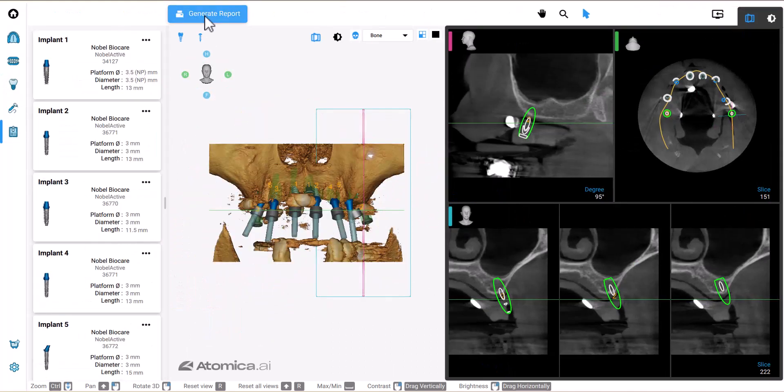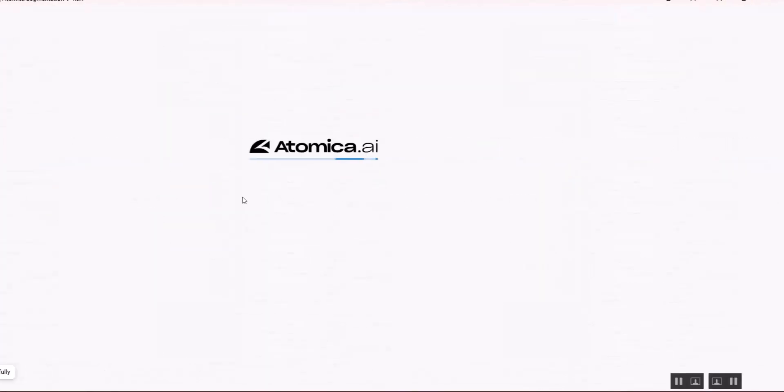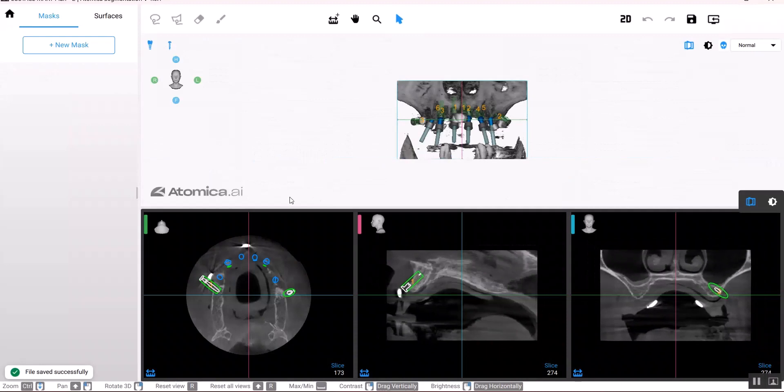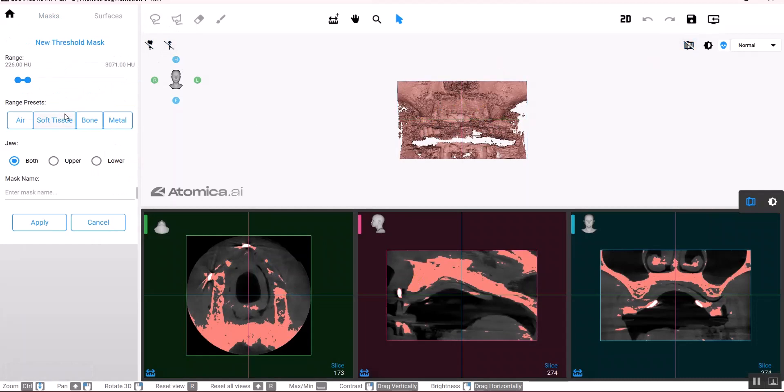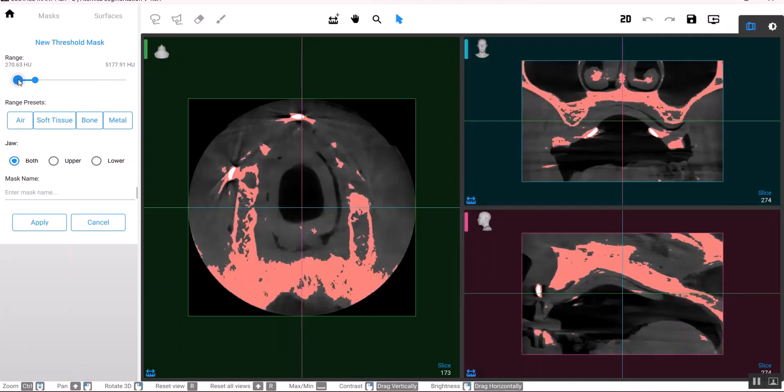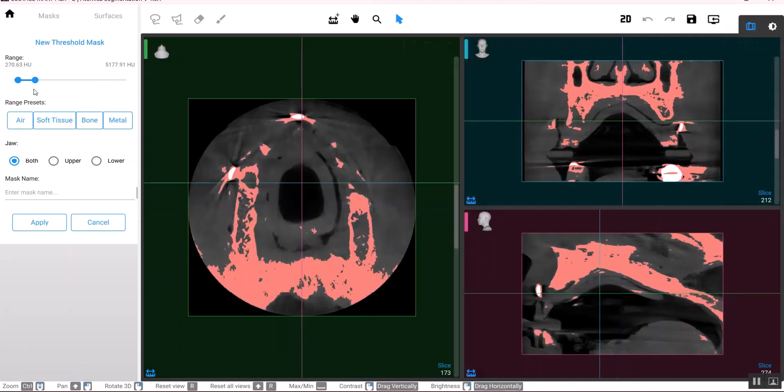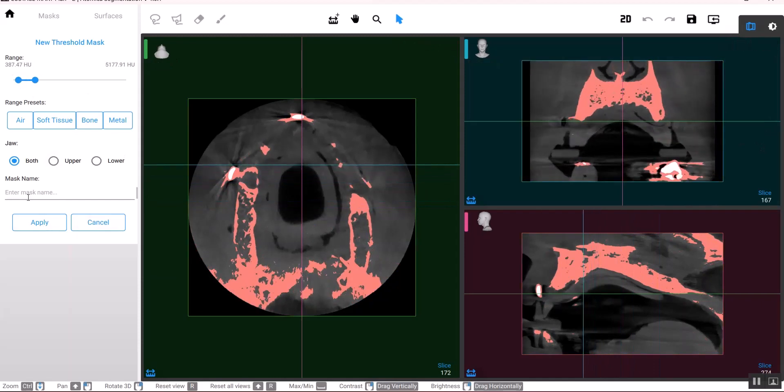I'll then head to the segmentation app and import the plan. Here we will generate a new mask for the maxilla. I'll keep adjusting the threshold to the point that it's almost marking the bone only, rename the mask like that, and then click apply.